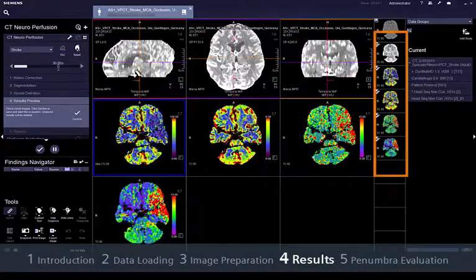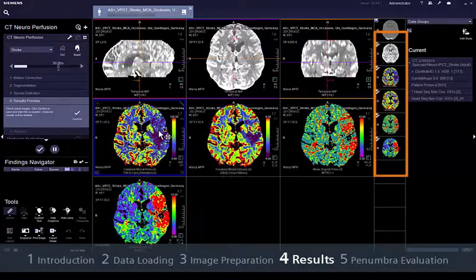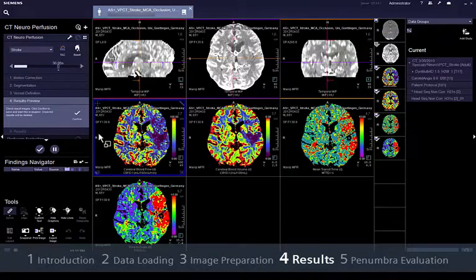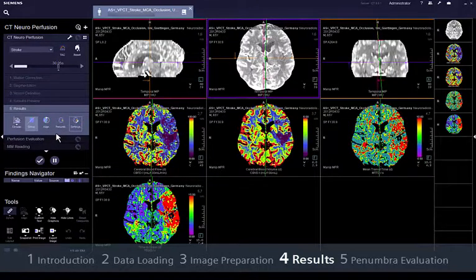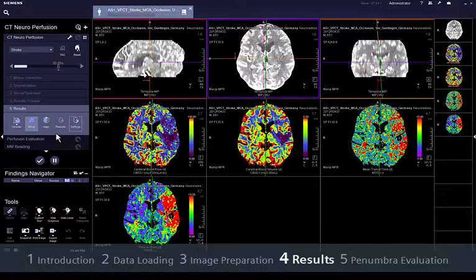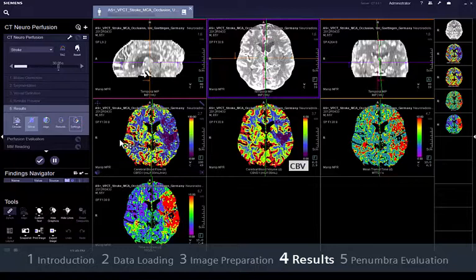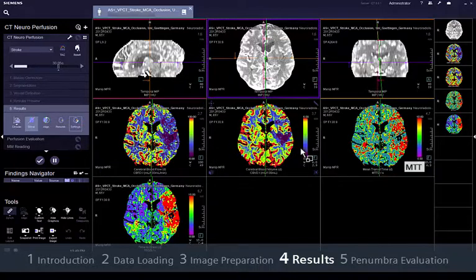Just make sure that the volumes that you want to proceed with are selected. If quantification is needed, proceed to step 5, results. All hemodynamically relevant perfusion parameters are displayed, including cerebral blood flow (CBF), cerebral blood volume (CBV), mean transit time (MTT), and time to drain (TTD).